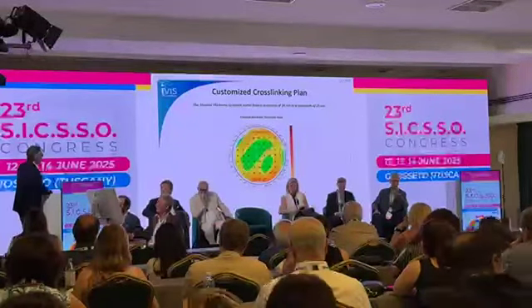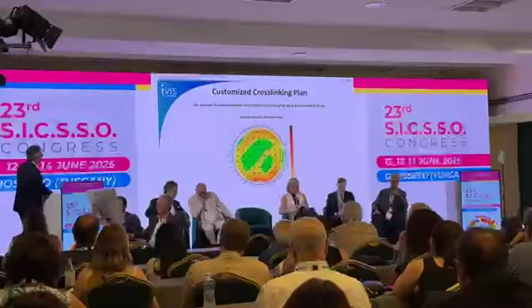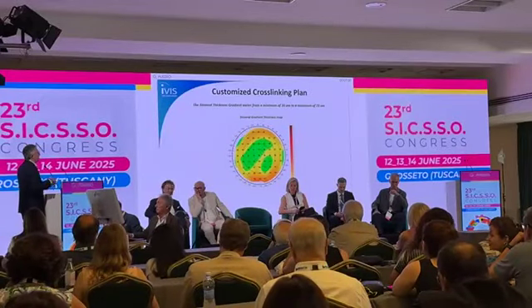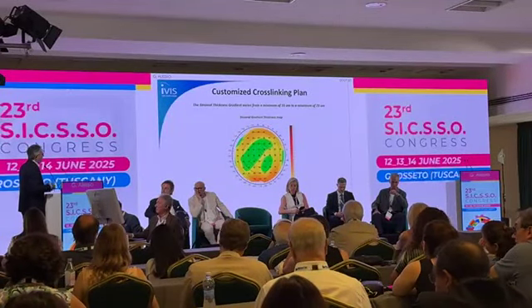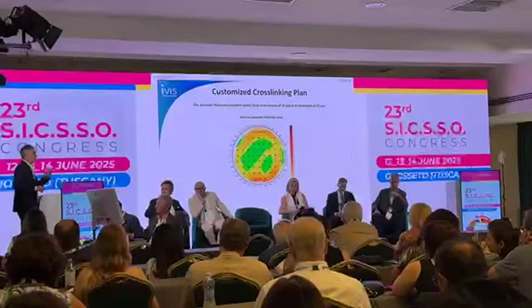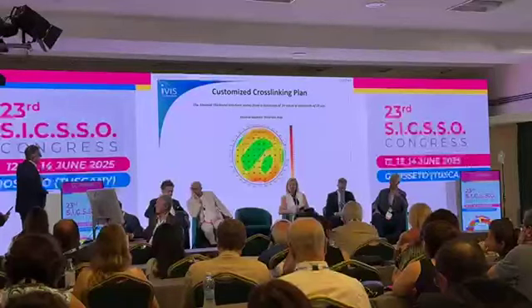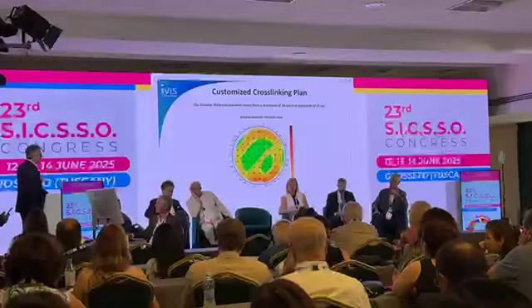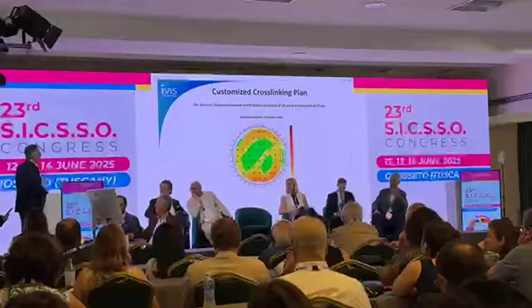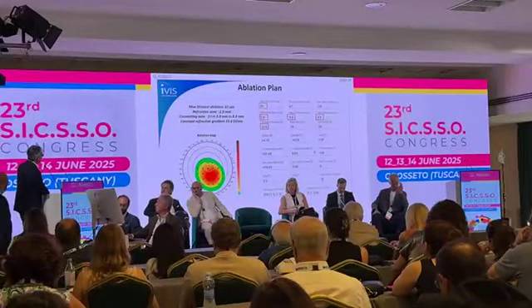In this case, the stromal thickness gradient varies from 16 microns to 73, and this is very important for the second phase of the treatment, the cross-linking, because the cross-linking is also customized. Where the gradient is higher, the energy will be higher. Where the gradient is low, the energy will be lower, and this is important for the final result.